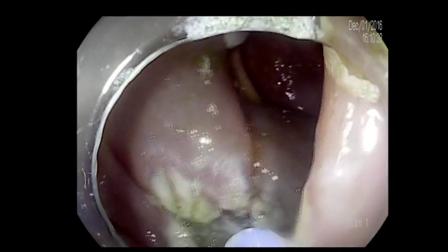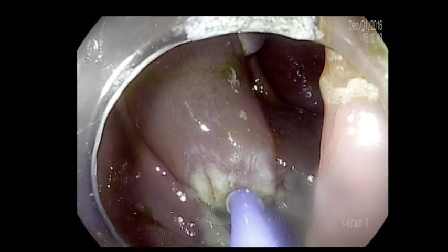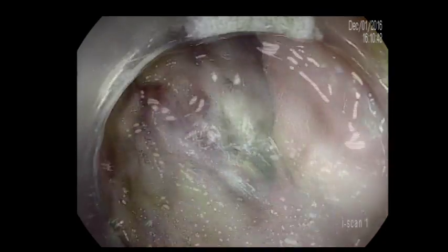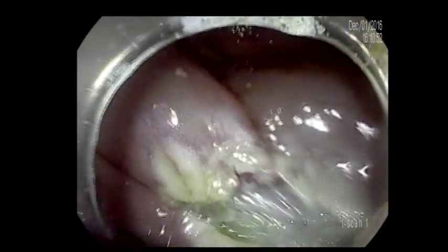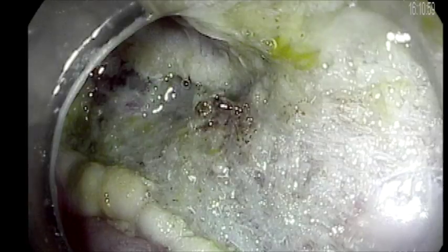So now we'll do argon plasma coagulation of the edge of the lesion to decrease the risk of recurrence. The lesson learned from this case: if you are planning for piecemeal polypectomy, it's better to inject piece by piece and avoid injecting the whole lesion at one time, to prevent the formation of valleys that will make EMR difficult.